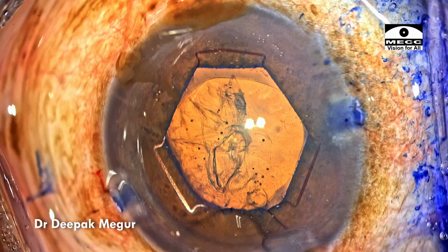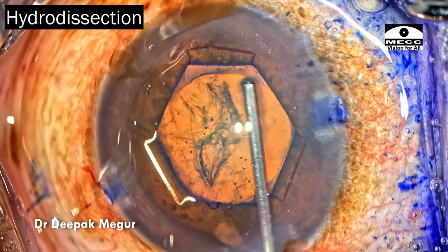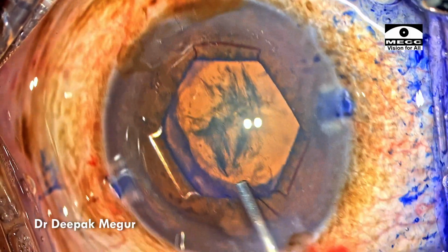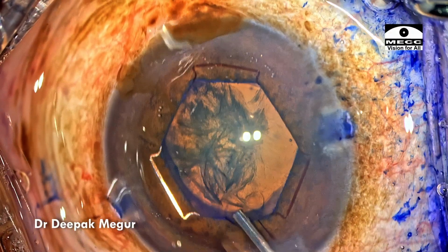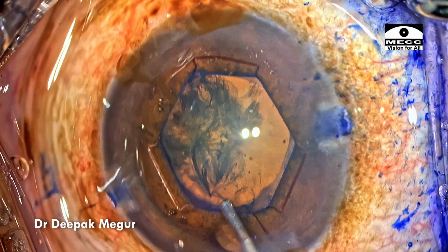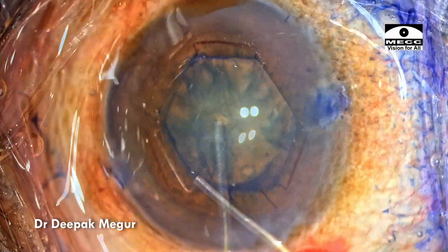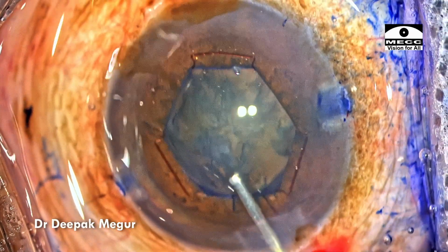Now, to add to our problems, hydrodissection is difficult in these cases simply because the lax zonules don't provide any countertraction for the fluid wave to pass across. So as you can see, I'm just trying to be very gentle and trying to push the fluid across the equator. It's not working. I'm going to attempt from another location. So a couple of attempts later, there seems to be some hint that the hydrodissection is completed.